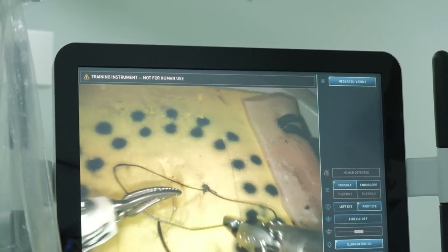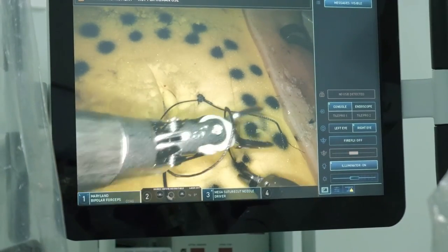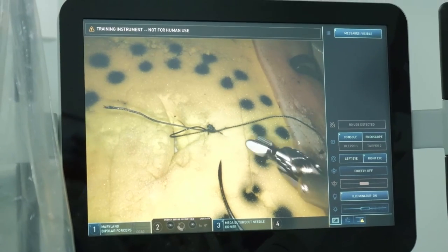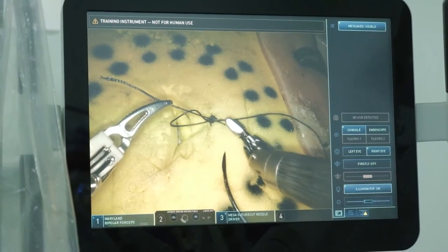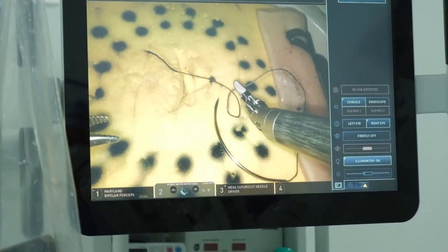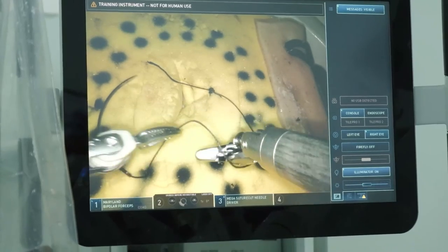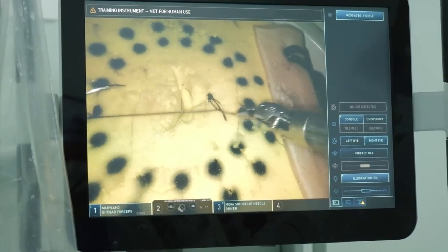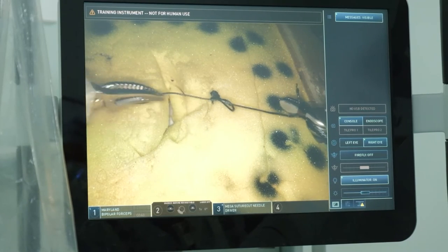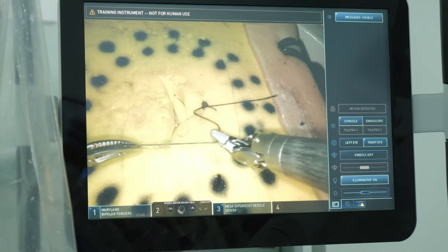So now we are zooming in and zooming out with the camera pedal in order to make our camera at a distance which we like, and we are taking this knot using these instruments with 7 degrees of freedom. So the view at the console is much better, but even on the screen the assistants can appreciate the final results.